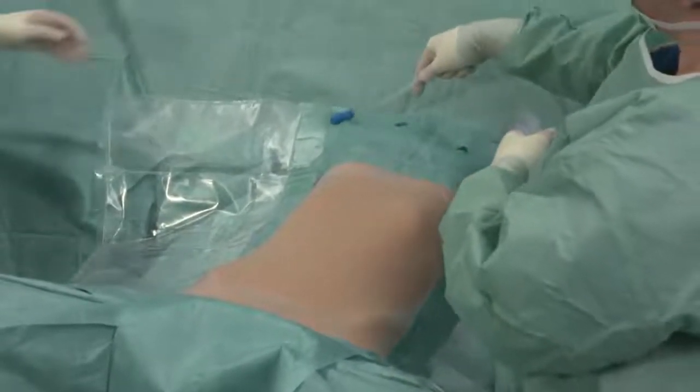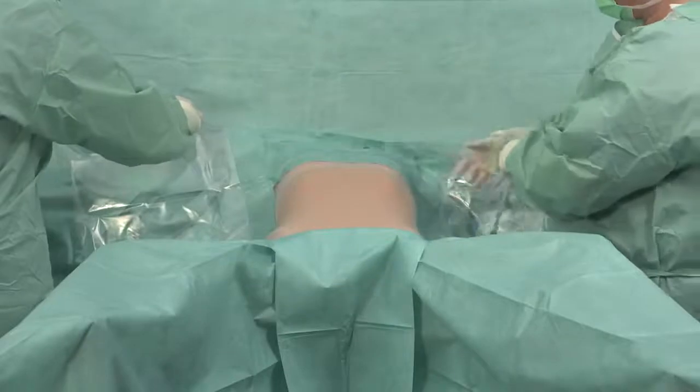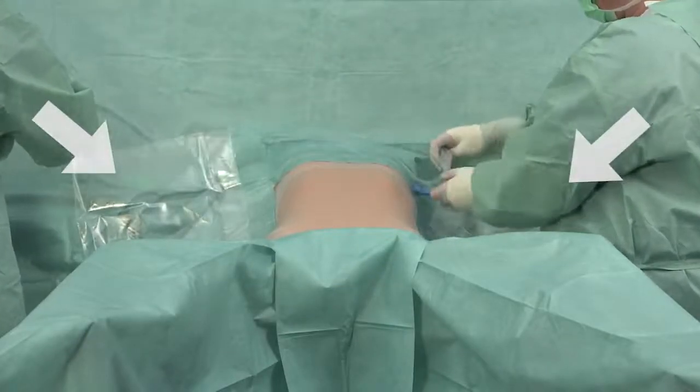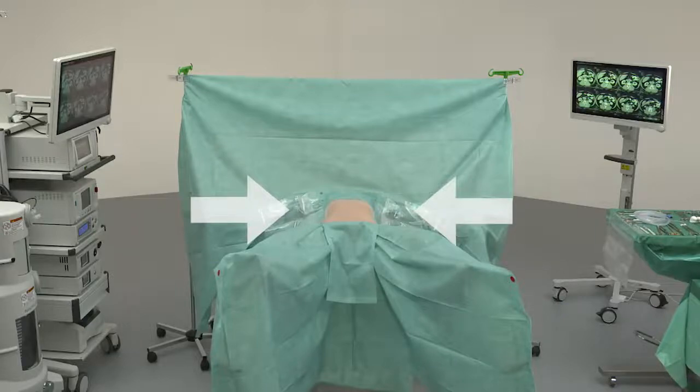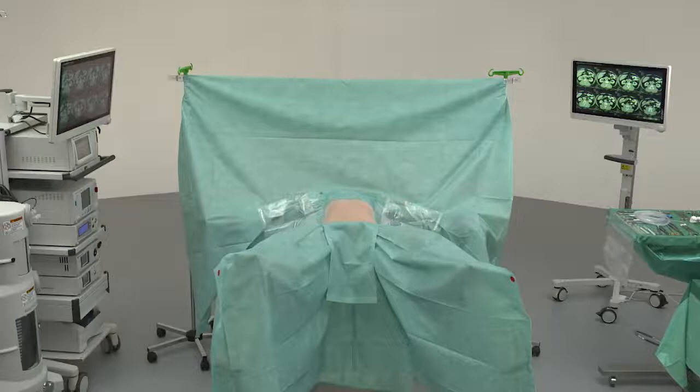There are also several tube retainers and two-chamber diathermy pouches. The integrated armrest cover also provides an adequate sterile barrier when relocating an arm. The rectum drape is suitable for both minimally invasive and open surgery in abdominal, perennial and vaginal areas.